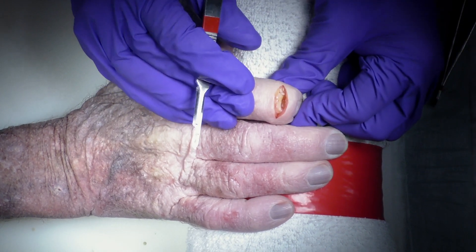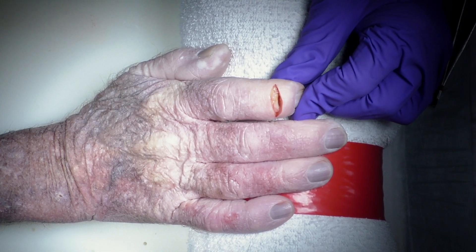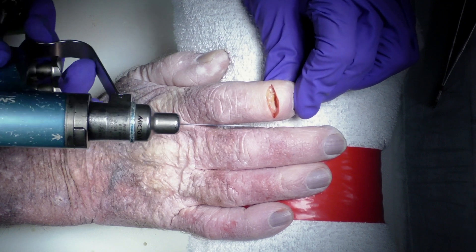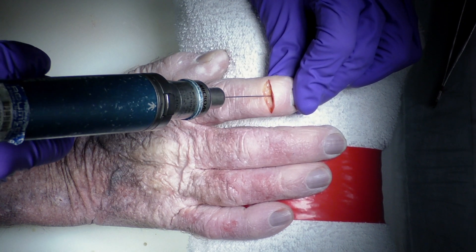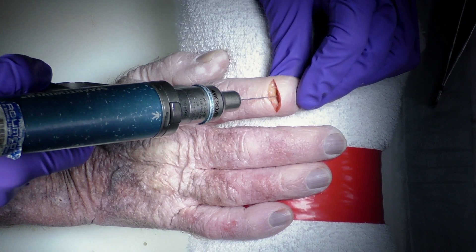Once we can see the joint, we can prepare the joint and then we'll use a double-ended guide wire in an antegrade fashion first, right through the base of the distal phalanx.